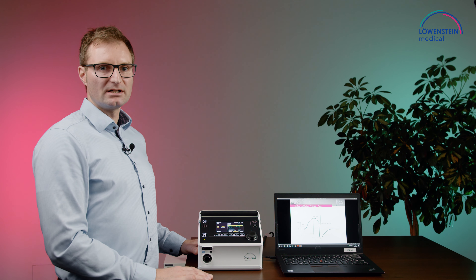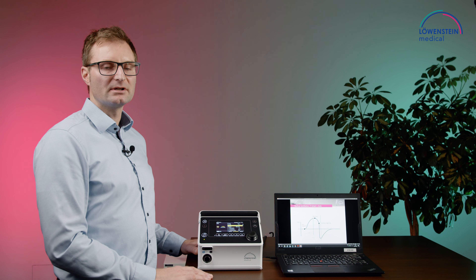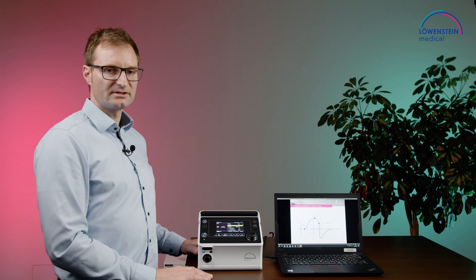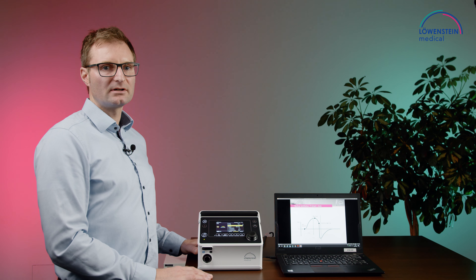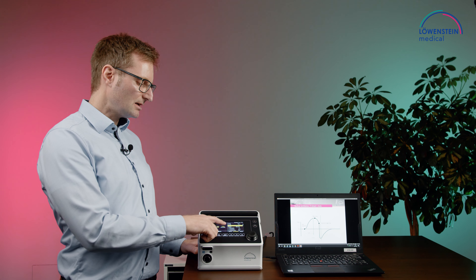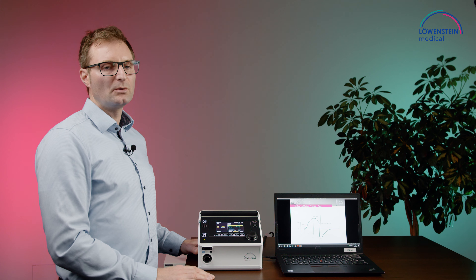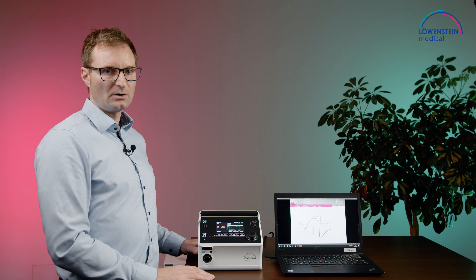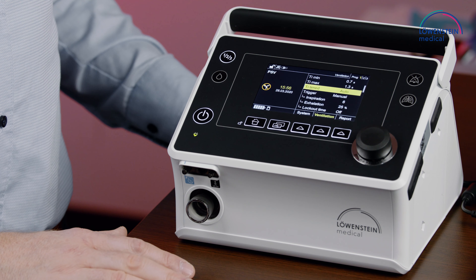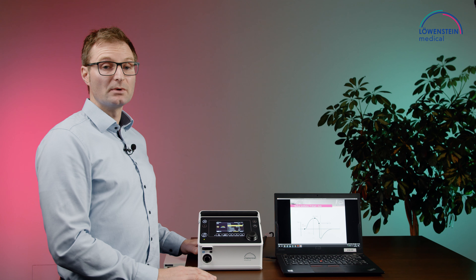Ti-min and Ti-max settings — minimum inspiratory time and maximum inspiratory time — are valid for the spontaneous part of the ventilation. Ti-timed, the Ti-timed setting, is valid for the backup ventilation. When Ti-timed is set to auto, like here, then Ti-min and Ti-max are still valid.